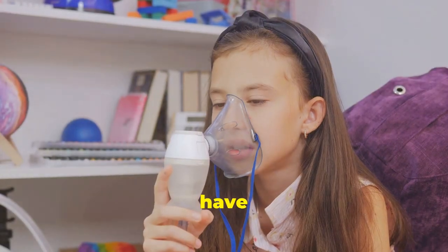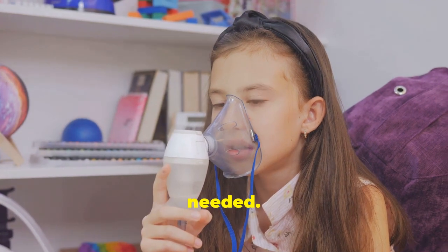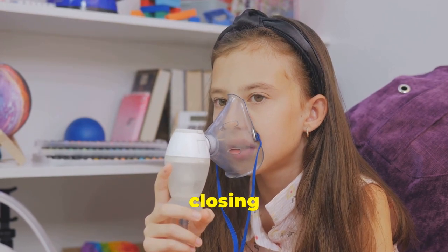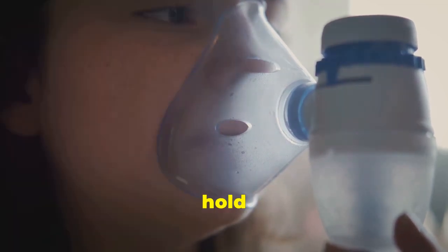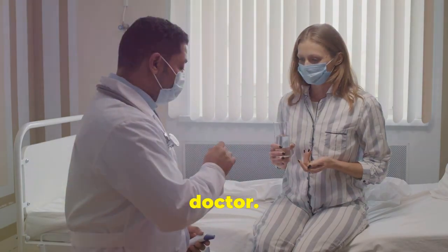If you do not have a spacer or choose not to use one, you'll need to prime your inhaler as needed. Shake your inhaler for 10 seconds. Exhale your air all the way. Place your inhaler in your mouth and close your lips. Gently start to breathe in, spray your inhaler, and continue to breathe all the way in. Hold your breath for 10 seconds, then exhale. Repeat as ordered by your doctor.